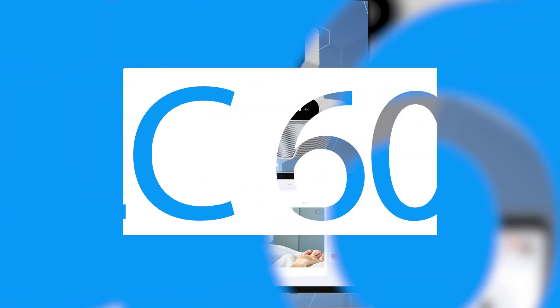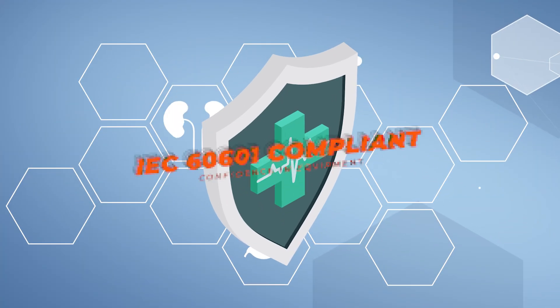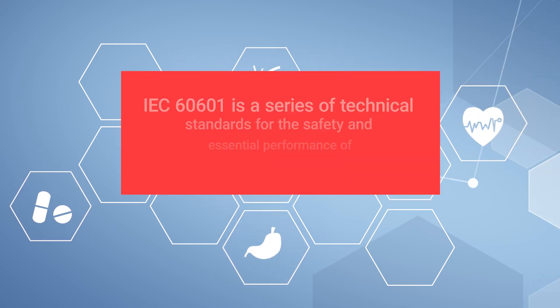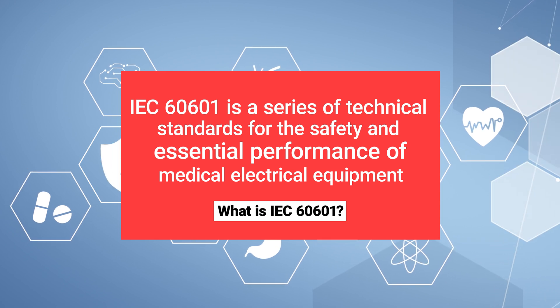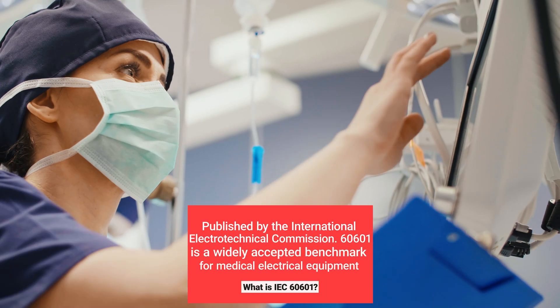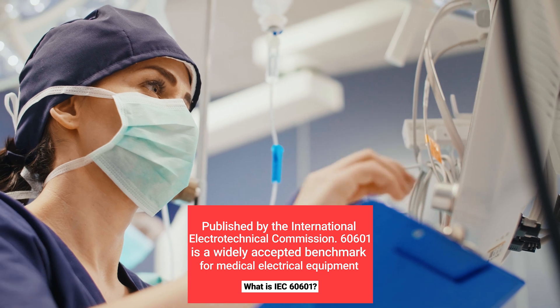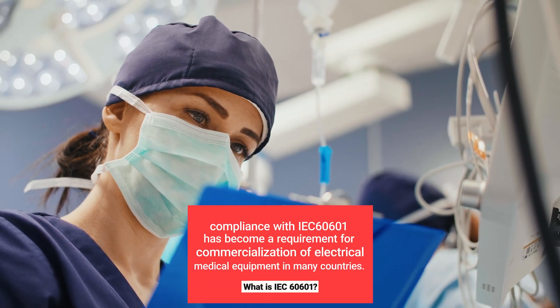Living up to rigorous testing, the Nutrix is IEC60601 certified to ensure a robust and high-quality medical-grade camera to help deliver the best healthcare. Thanks to meeting this standard, the Nutrix is well-adjusted to the medical field, ensuring it is able to deliver the needed medical imaging while offering uncompromising reliability that can stand up to the most demanding medical environments without interfering with other medical equipment.